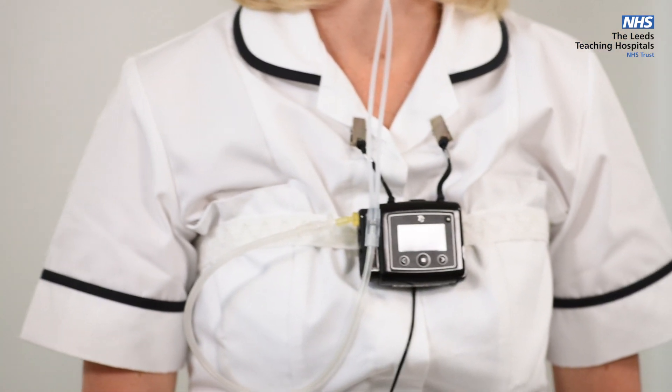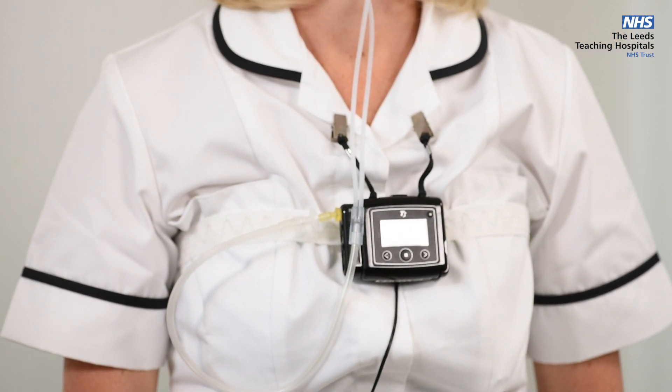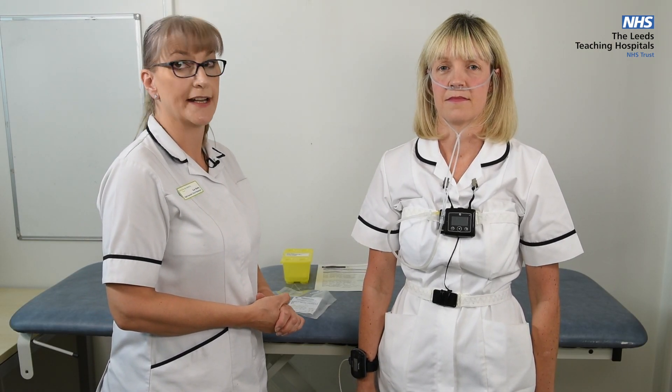You're now ready for your sleep study — go to sleep. The machine will switch on automatically at 10 o'clock, unless another time has been arranged with you and the department.